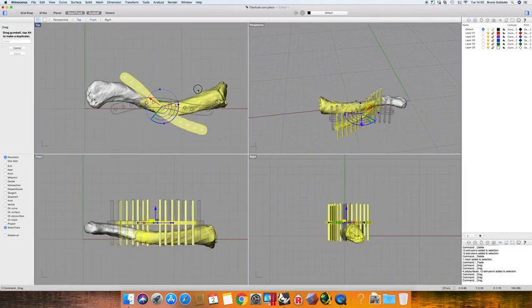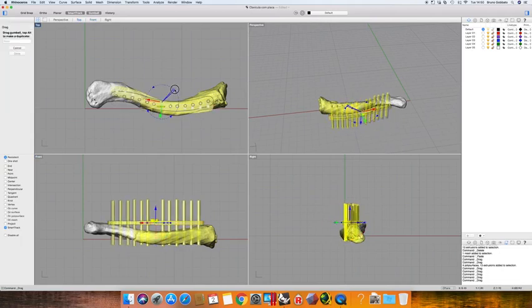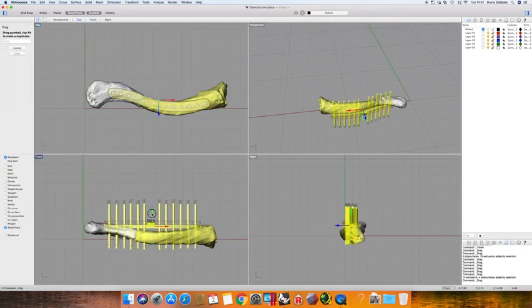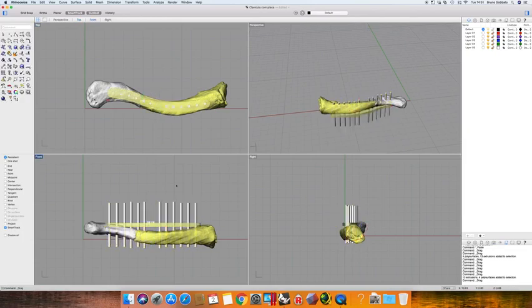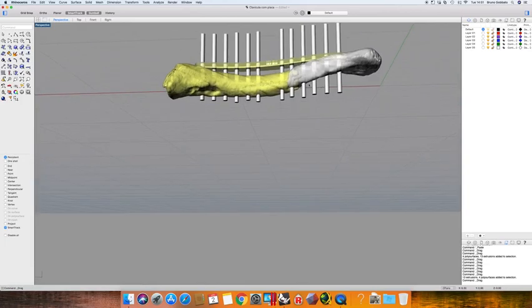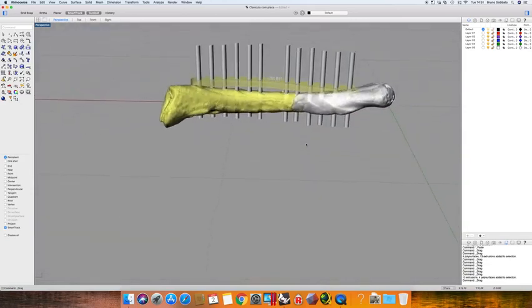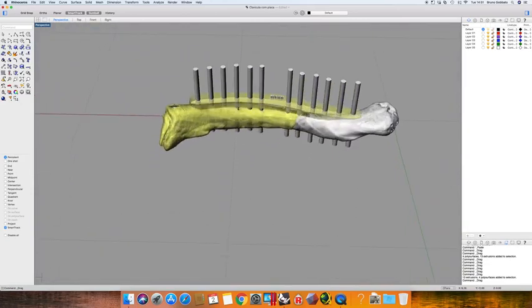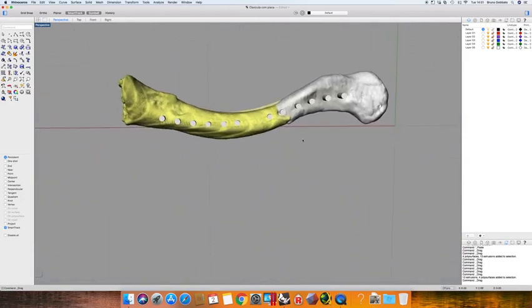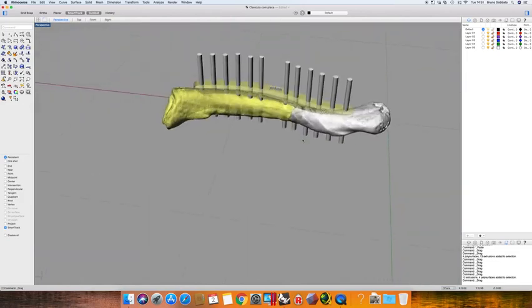We can check the correct position of the implant wherever we want, as you can see here, just like that. For example, let's put it a little bit like that. And this is why I choose having the screws from above and behind, not just as a plate. And this is important when we design patient-specific guides. So here we can see all the screws, and how it will be in our clavicle.